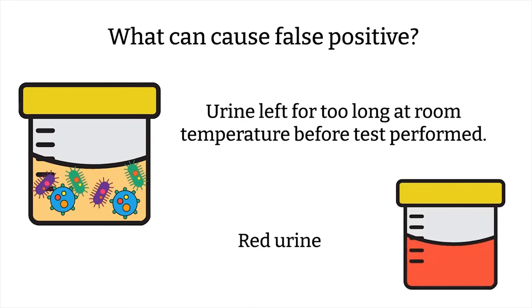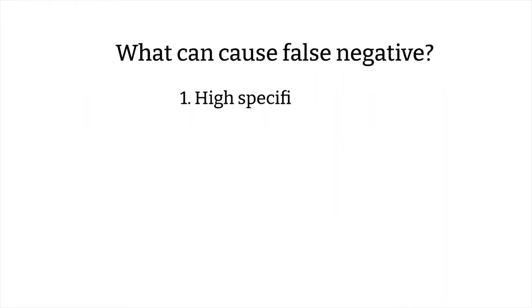For false negative test results, high specific gravity and a high level of ascorbic acid can give false negative test results.